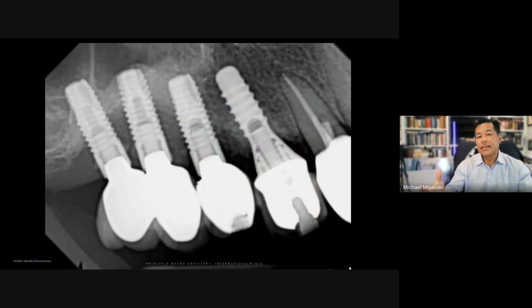So how do we communicate that to our patient? Because this is a case where underneath the bone, you can see we have bone loss. So we have peri-implantitis. The patient has no pain. If they do follow any kind of oral hygiene regimen, it doesn't have a lot of bleeding. They don't have a lot of inflammation in that area. So how do we communicate the importance? We see that these implants could just fall out soon because we know that large osseous defect and the difficulty of keeping that clean means this is going to progress, and it could progress at a very rapid pace.